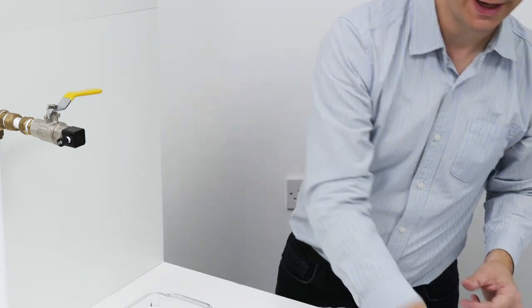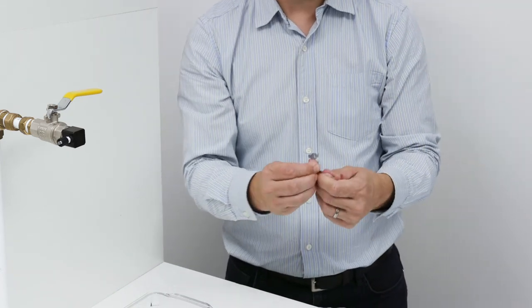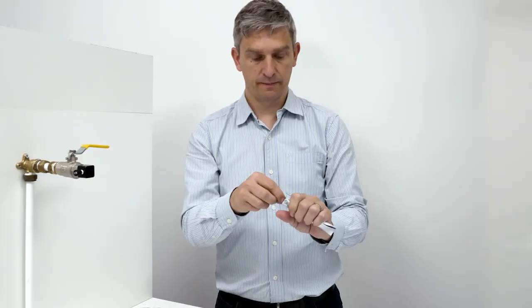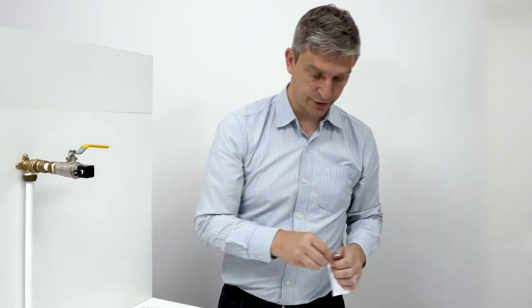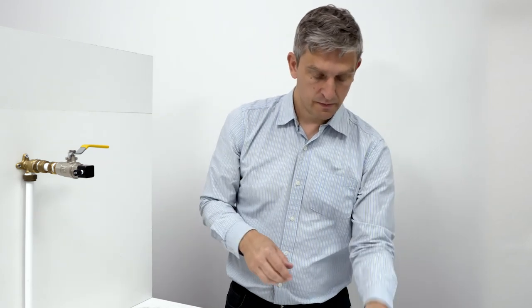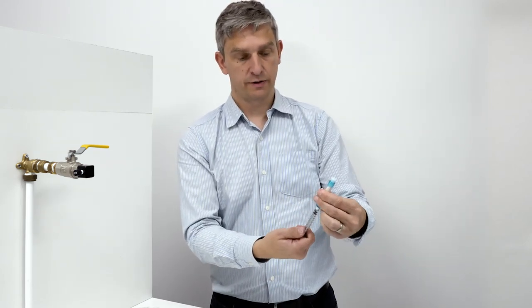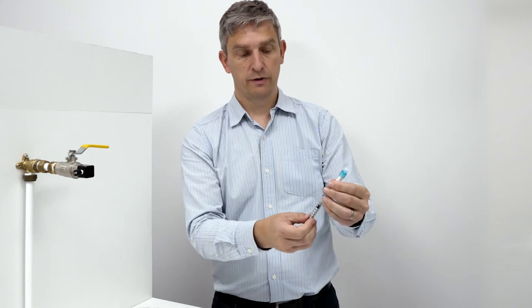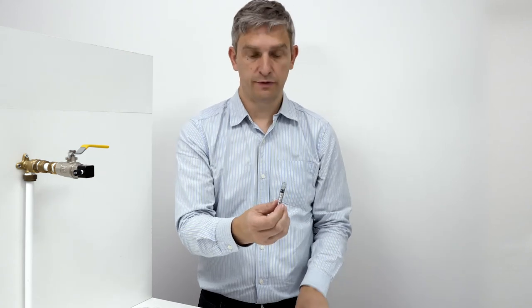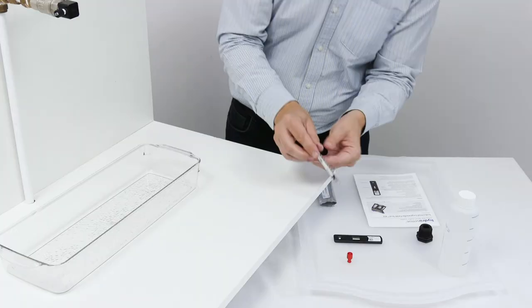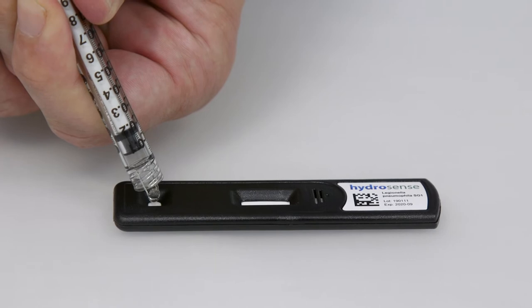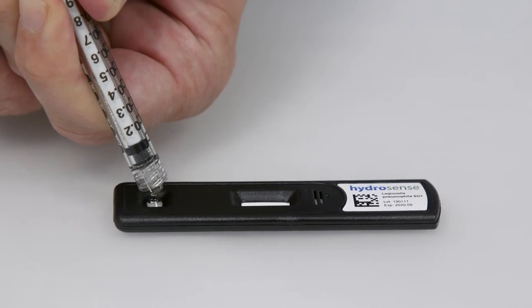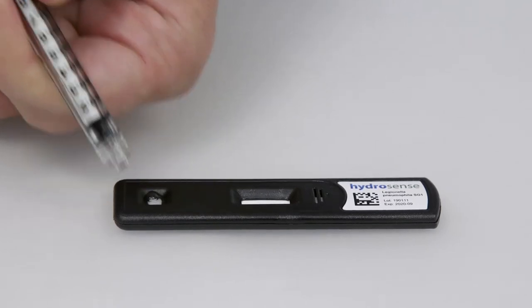We now need to open the test, and we only open the test just prior to running. Place the test on a flat surface, then detach the filter from the syringe and put the filter to one side. Then we dispense the 0.1 milliliters onto the test strip. Ensure that all the sample is dispensed onto the test strip.